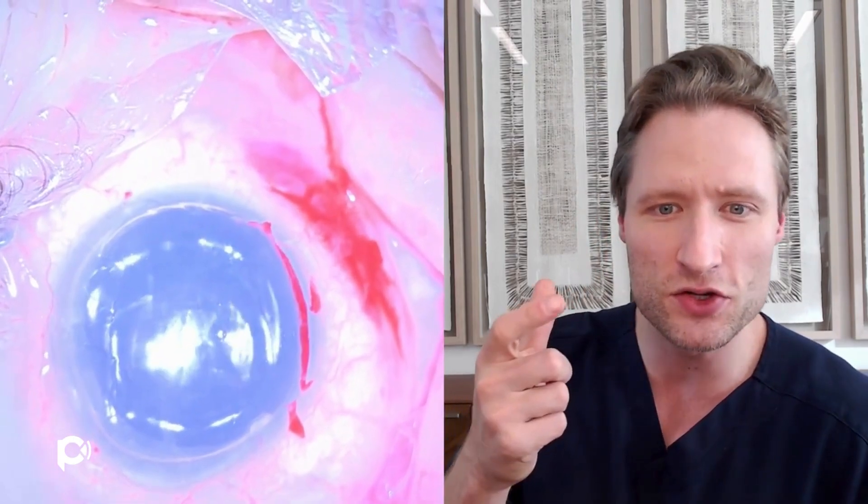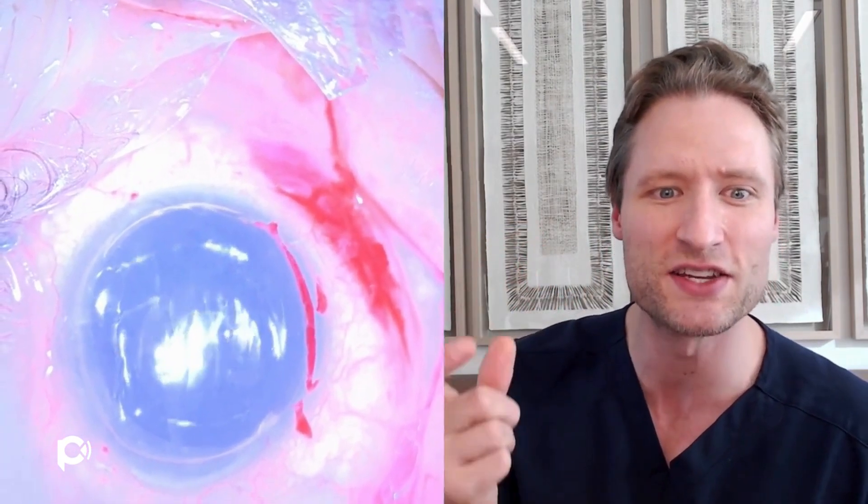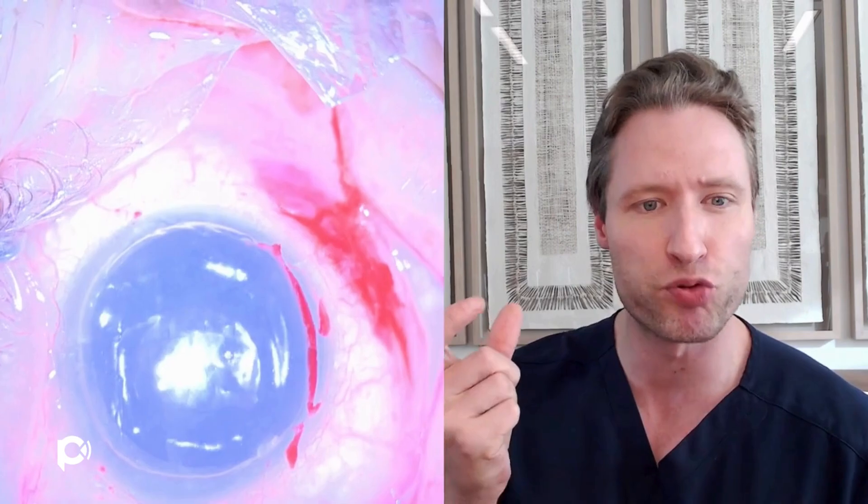The way to prevent that is: first, fill the anterior chamber with air — not to pressurize the eye but just to occupy the space. Once the AC is filled with air, you pressurize the globe by injecting BSS with a 30-gauge half-inch needle into the pars plana. That syringe with a 30-gauge sharp needle is being used to inject BSS to pressurize the posterior segment. Once the posterior segment is pressurized and filled with BSS, you can put more air in the anterior chamber — that pressurizes and sticks the graft up against the back of the cornea without losing air into the posterior segment.